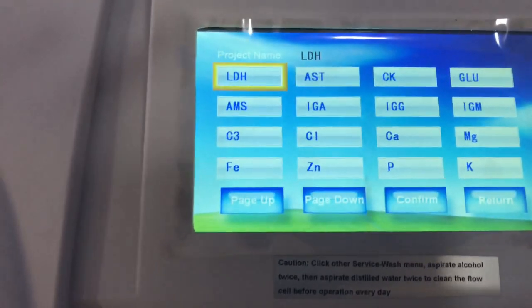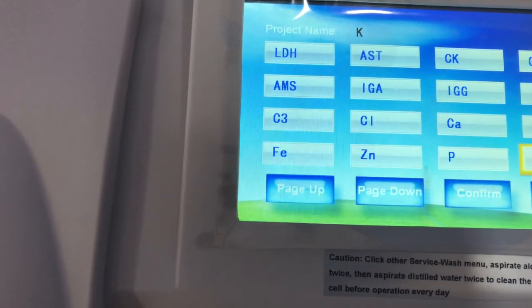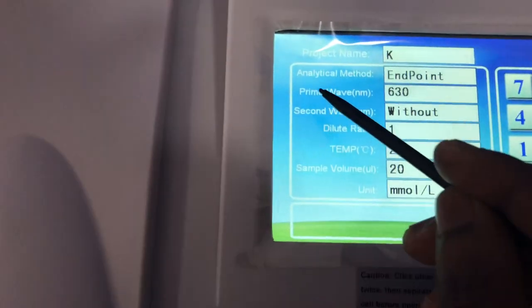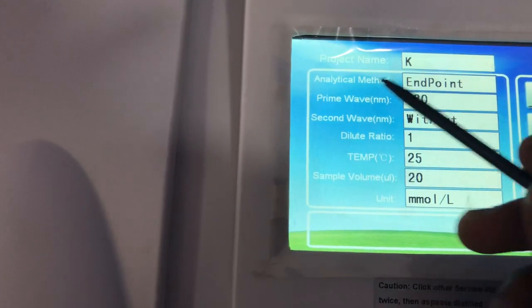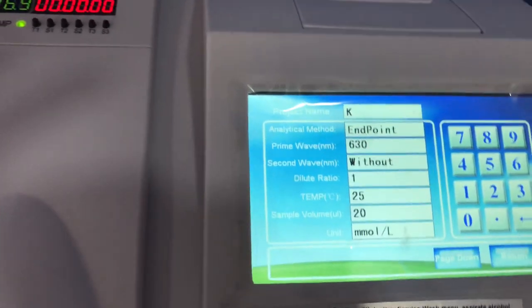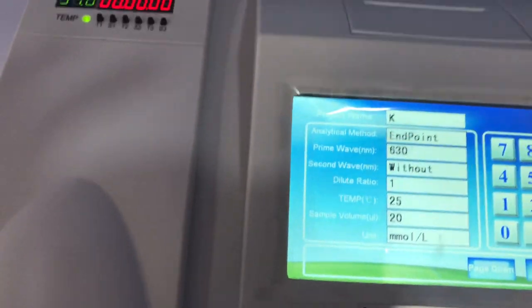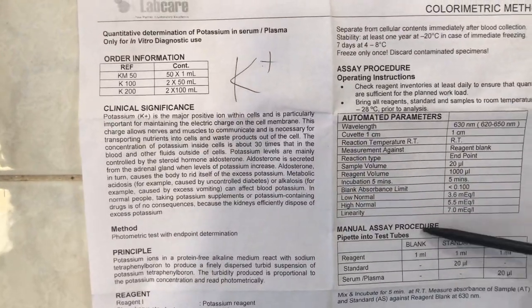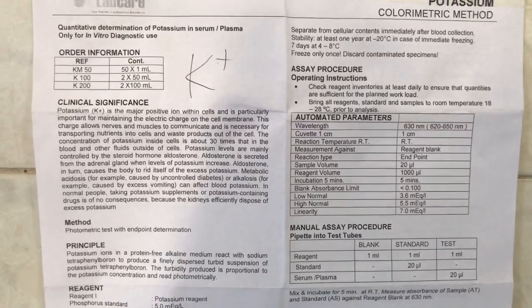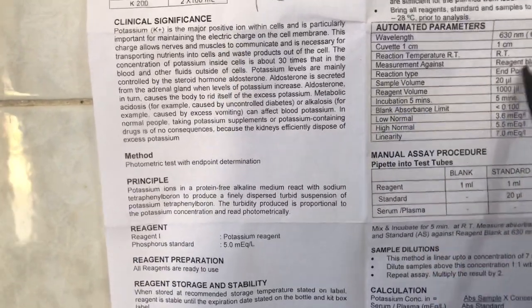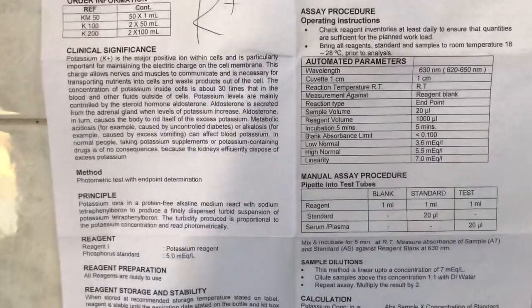Let's assume we want to program potassium. You click on potassium and then click confirm. You click on the project to edit it and navigate to the analytical method. To know which analytical method to use — endpoint, in this case — it's the manufacturer of the reagent that tells you. This reagent was manufactured by LabCare, and the assay procedures give you all the parameters you need to program your machine. The reaction type is endpoint.